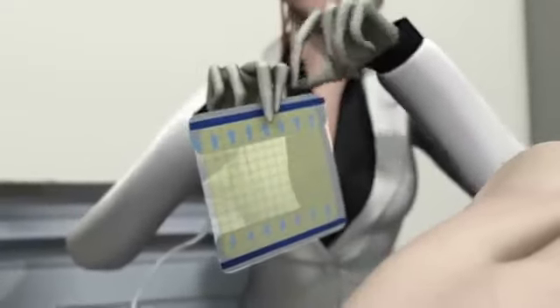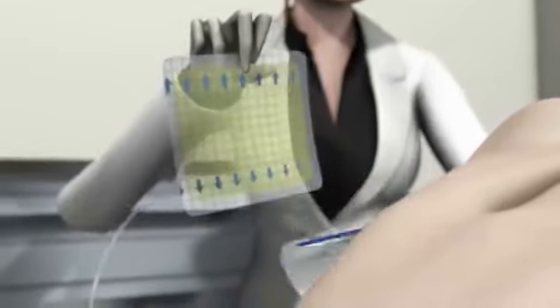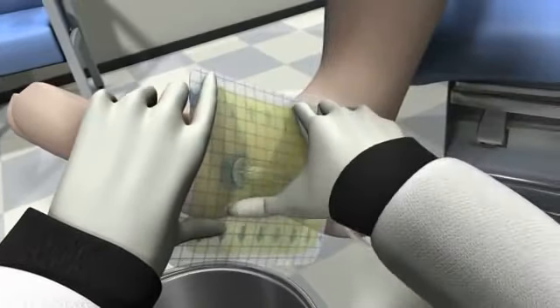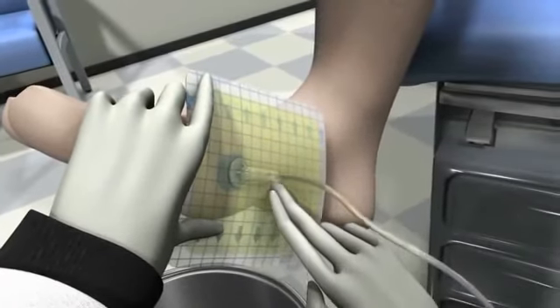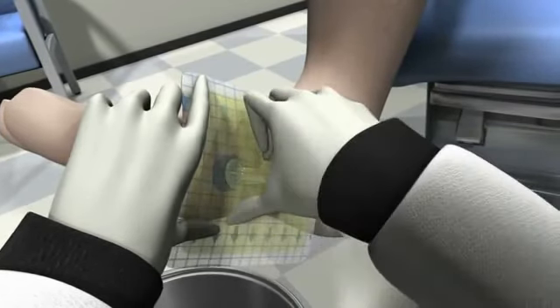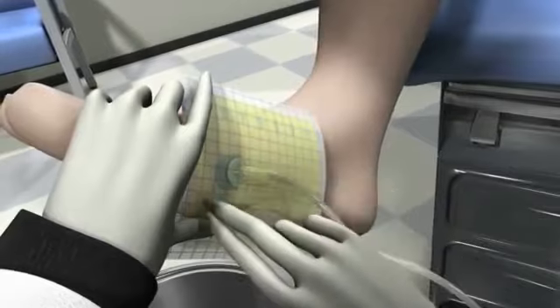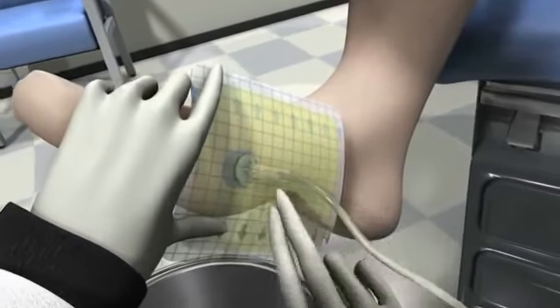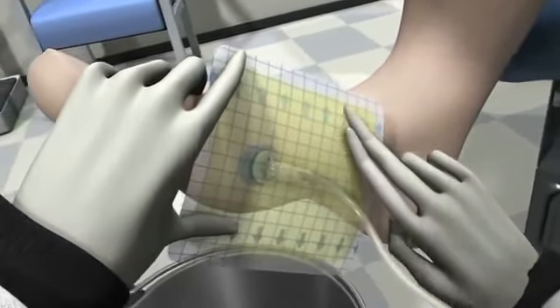To begin application of the SNAP wound care system, slowly peel away the center release liner as you carefully place the SNAP dressing over the wound. Ensure the center opening of the port is placed directly over the interface dressing. Use your hands to smooth out the hydrocolloid dressing onto the skin and remove any small creases.